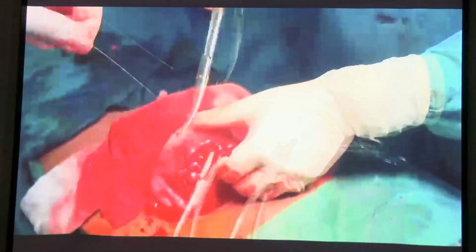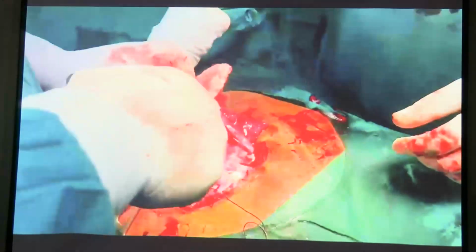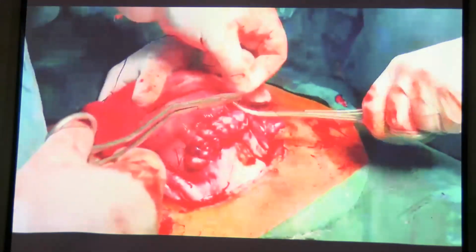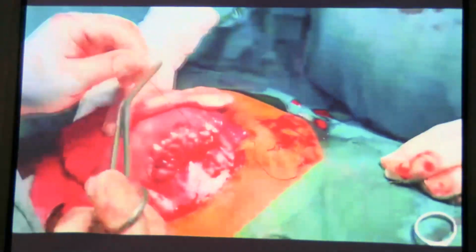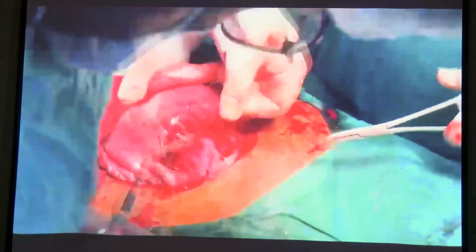See, we finished the suturing 1 layer. Some parts we are going to give 2 layer, huh? In some parts we are going to give 2 layers. যেখানে যেখানে অল্প বিস্তর ব্লিডিং আছে, we are giving hemostatic sutures. These are hemostatic, figure of 8 hemostatic sutures. সব absorbable. These are figure of 8 sutures or box sutures, hemostatic sutures.